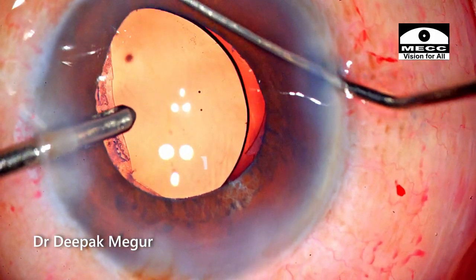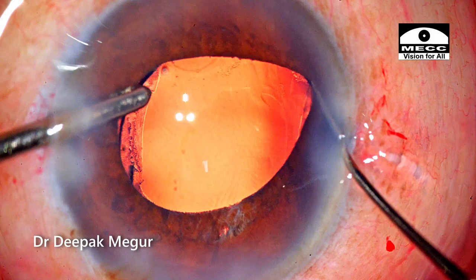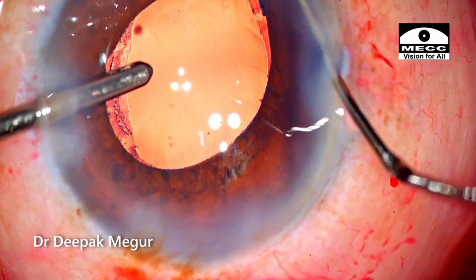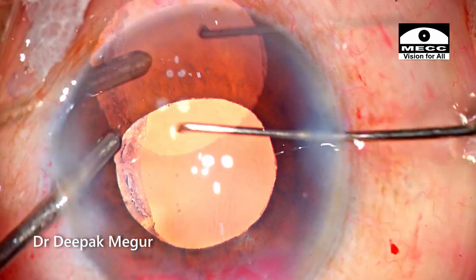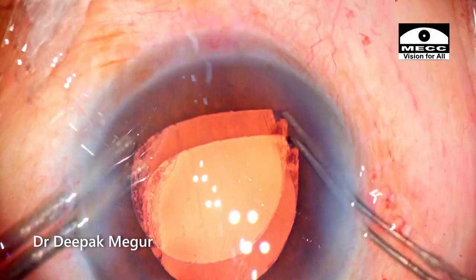Once the OVD is cleared off, now is the time to align the intraocular lens. With the chamber being maintained by the irrigation handpiece, I'm using the Sinskey hook to rotate the lens to ensure that both the haptics are away from the area of discontinuous rhexis. Just checking that the lens along with the haptics are within the bag. That's it, the case is done.